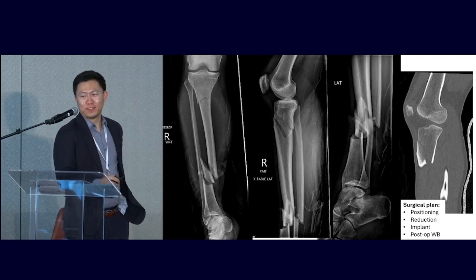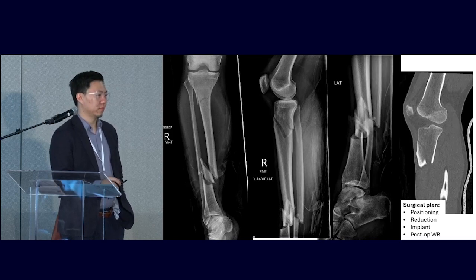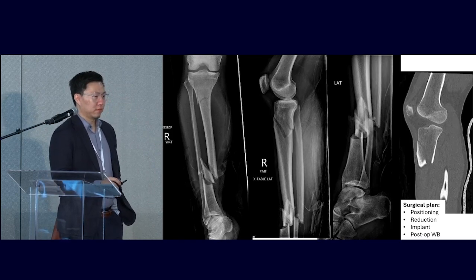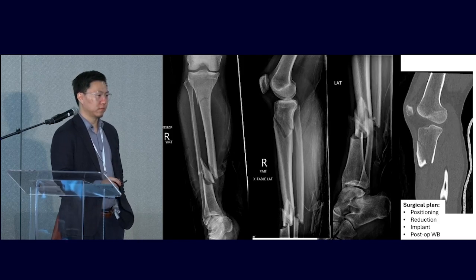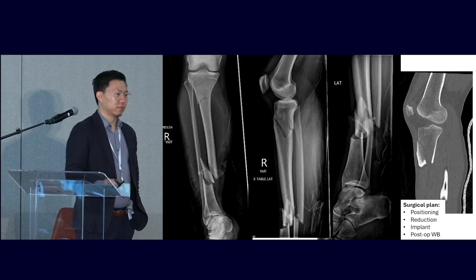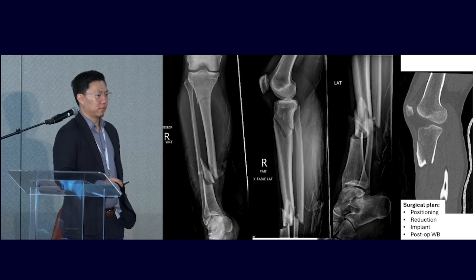So, second incision? Yeah, I worry about the medial surface of the tibia. You know, it's not a very forgiving area. I just did an open distal humerus a couple days ago, and the poke holes were way over the side, and we did a posterior incision, and just ignored the poke holes and washed out the fracture. So I usually advise the patient for sure, but if it's a poke hole in a dangerous place, then yeah, I make a separate incision.